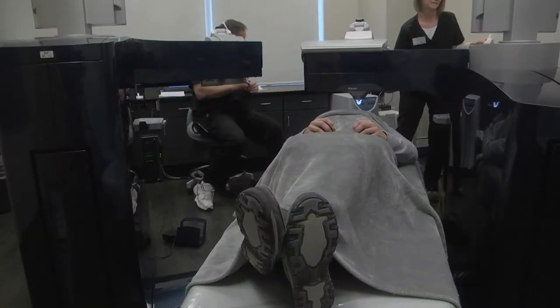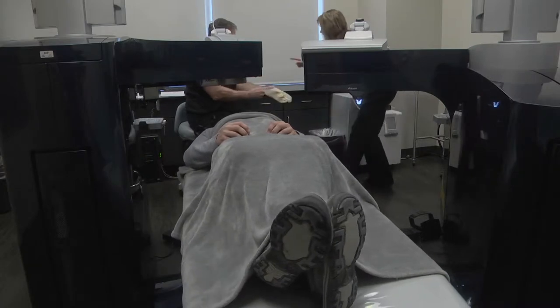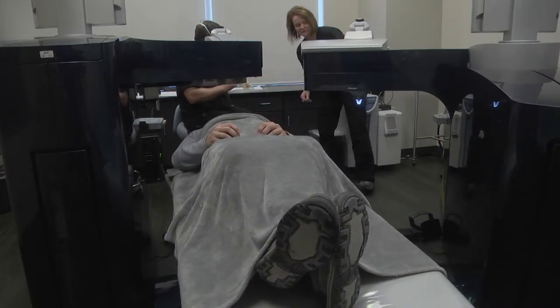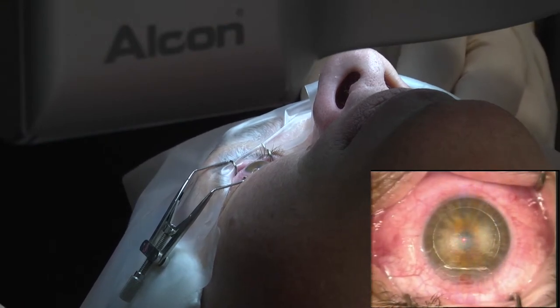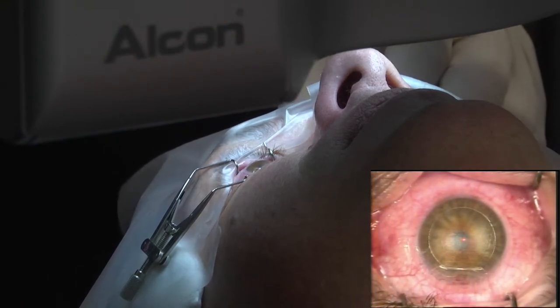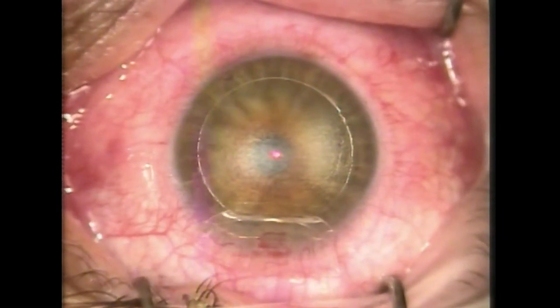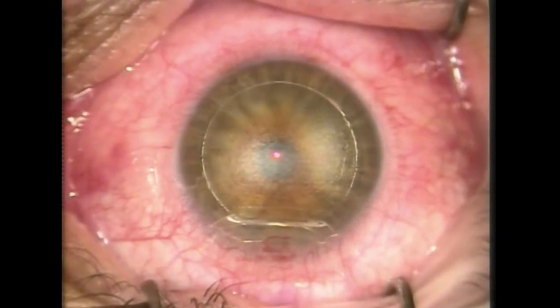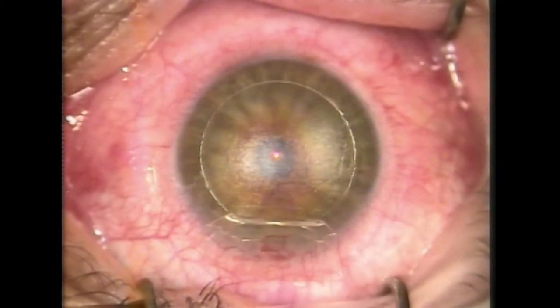This bed's going to rotate to the laser that does the correction. So you just keep relaxing. Now I'm going to have you look at the blurry green light. The tracking device is locking on — it's just beautiful how it follows the eye. Just don't worry about the noise, just keep concentrating on the green light.